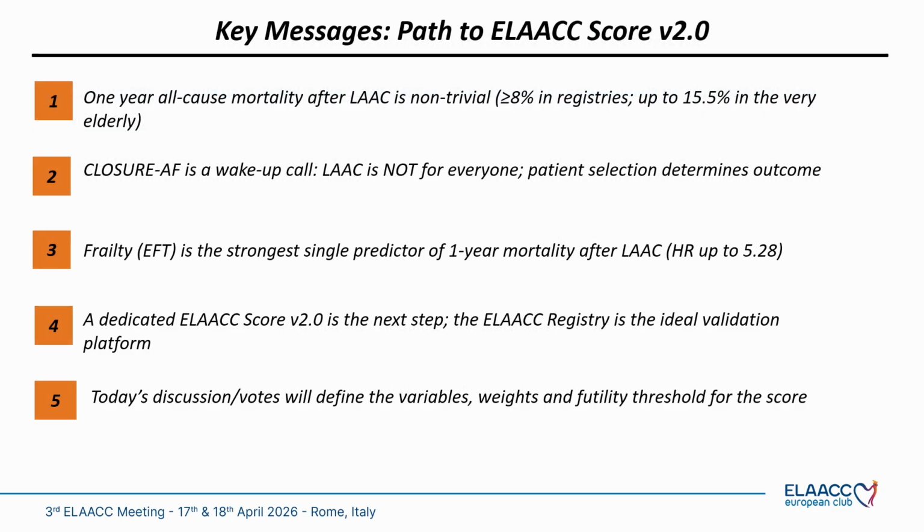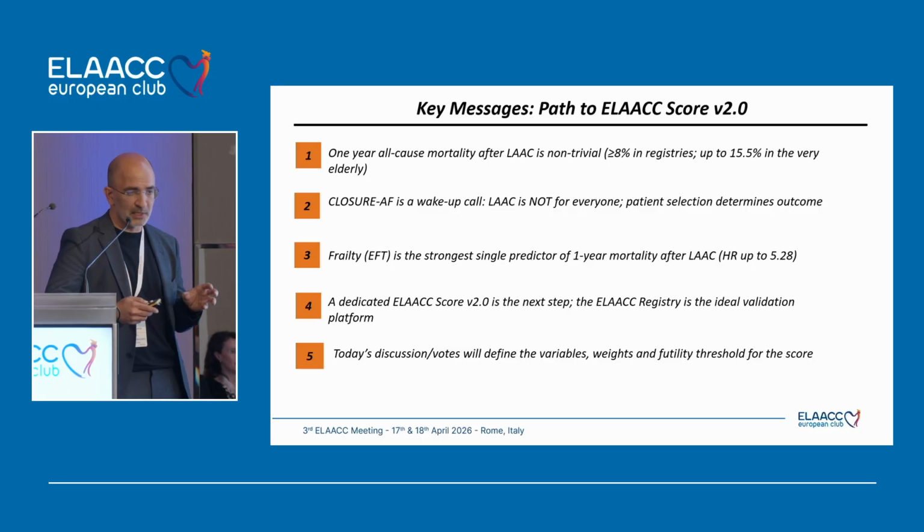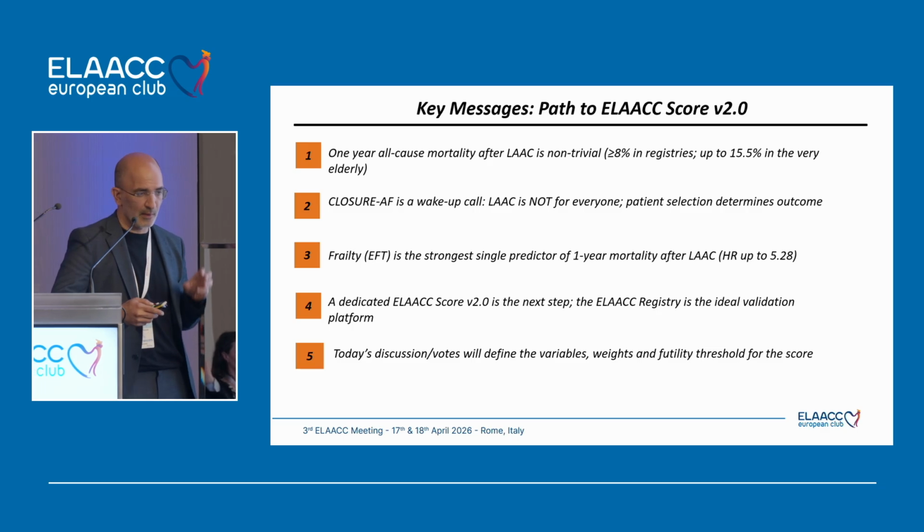So my key messages: the 1-year all-cause mortality of LAAC is non-trivial. It's more than 8% in many registries, up to 15% in the very elderly. So closure AF is a wake-up call. LAAC is not for everyone. Patient selection will determine the outcome.